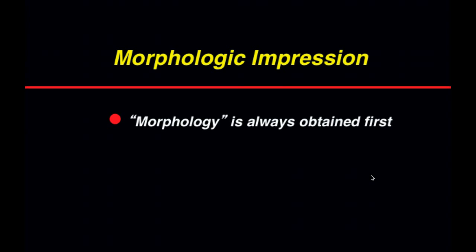Can you imagine instructing your sonographers, if you see a mass in the ovary, under no circumstances take a picture of it. Simply find an arteriole within it, measure the resistance, write the number on a piece of paper and put it on my desk. Idiotic. No one would do that.